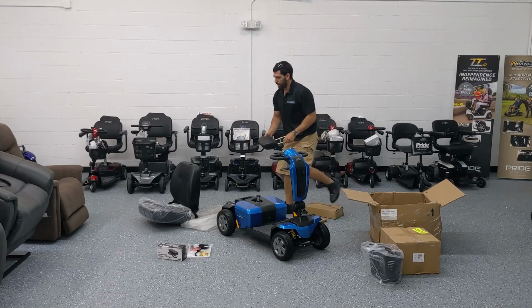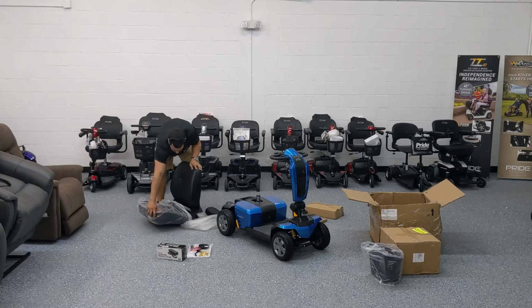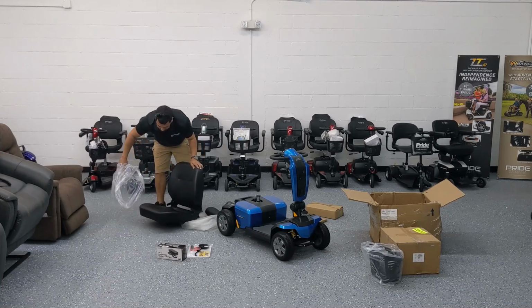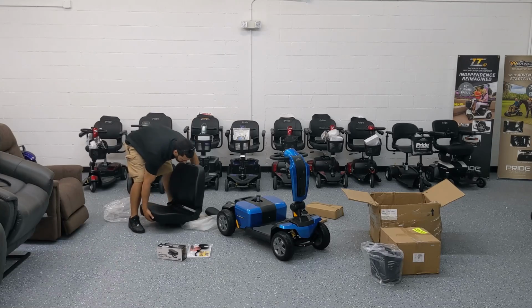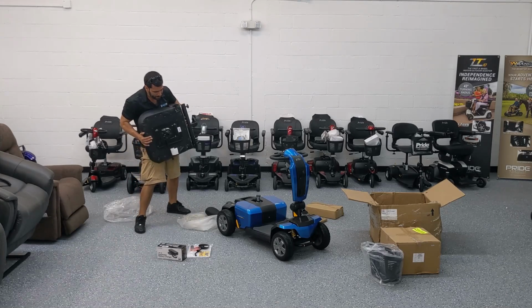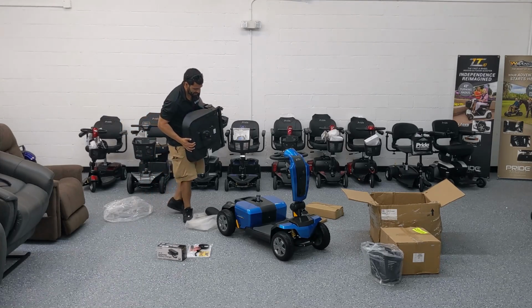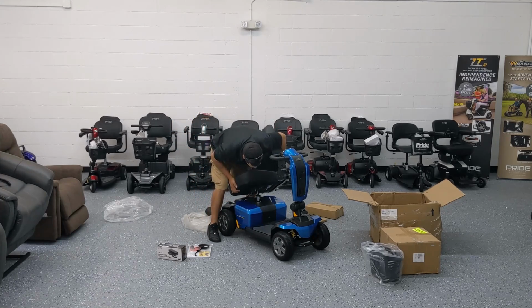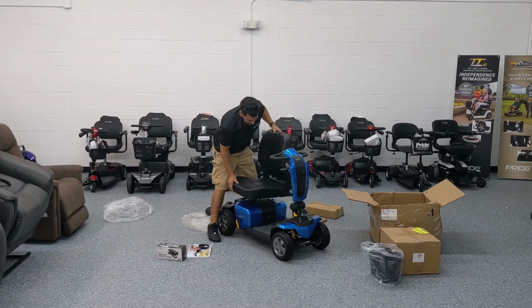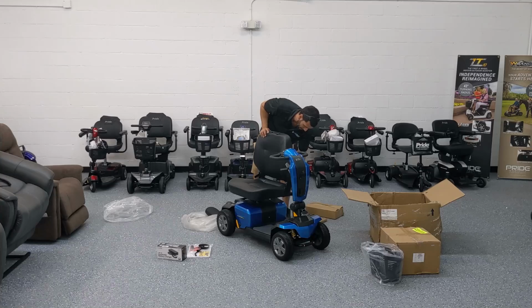Now I'm going to put this down for a sec, continue to unwrap the seat. And now this seat at the bottom, just like any of the Pride scooters, has a male end, and the seat post has a receiving end that you can just literally put the chair right on, and it rests right into it and gets locked in automatically. There's no tools required for that.